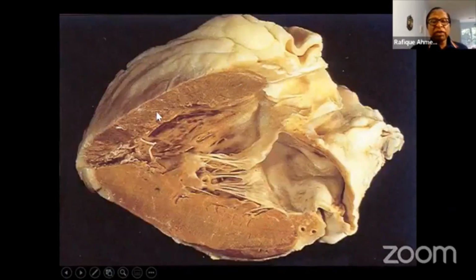And this is a longitudinal section of the left ventricle. As you can see, this is the papillary muscle, and then these trabeculae connect to the valves, holding it and preventing it from prolapsing into the left atrium. And this is the left atrium. This is one of the coronary arteries and probably the coronary sinus.